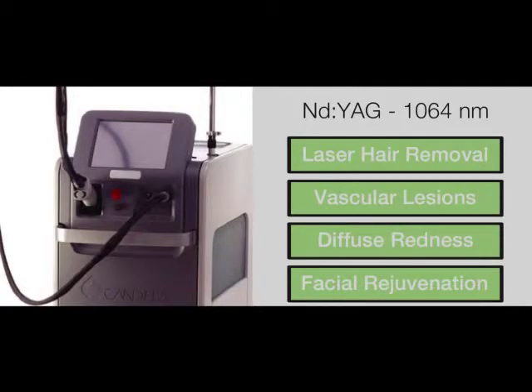Nd:YAG 1064 nanometer wavelengths for laser hair removal, the treatment of vascular lesions, diffuse redness, and improvement in skin texture.